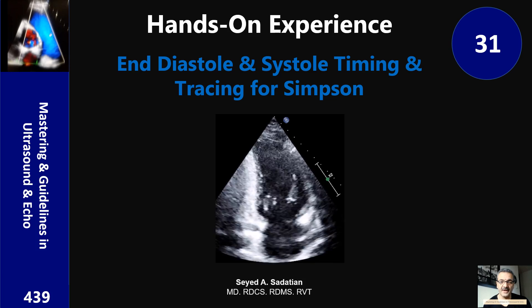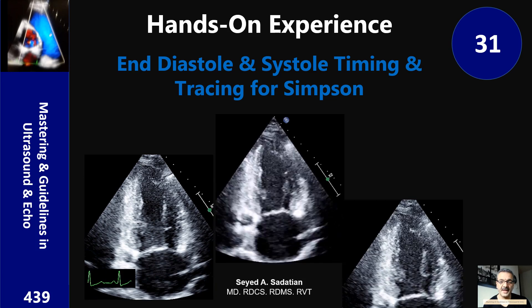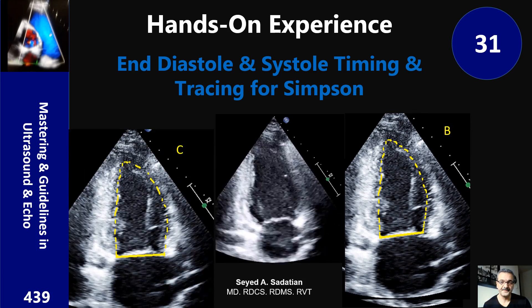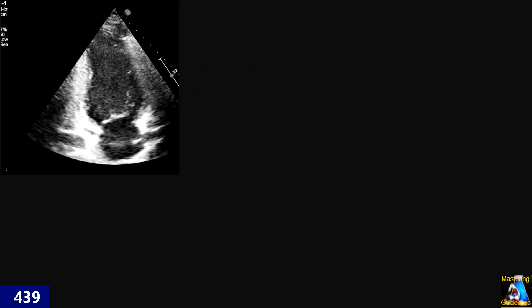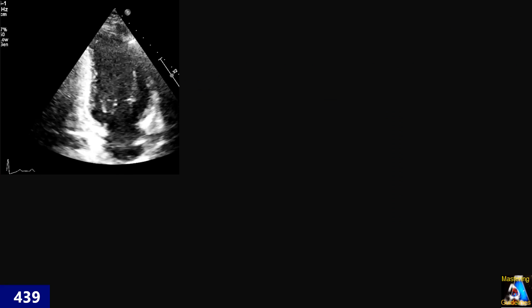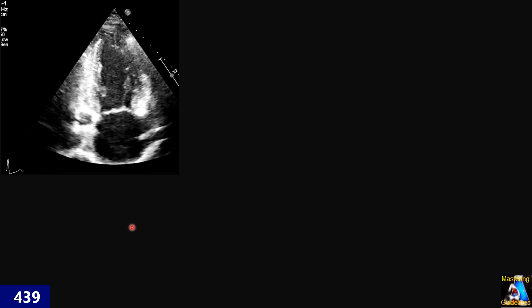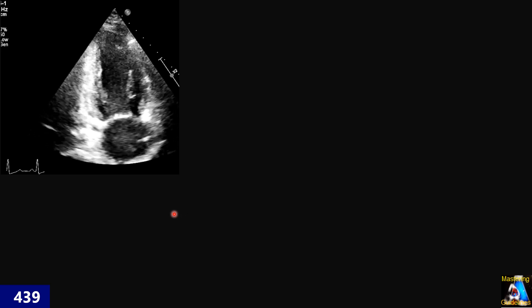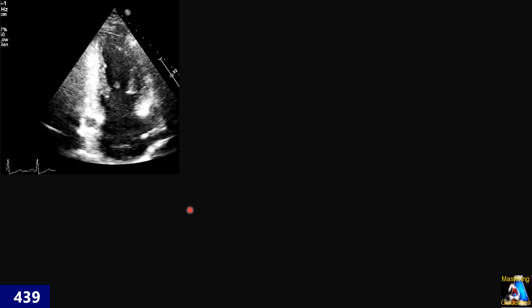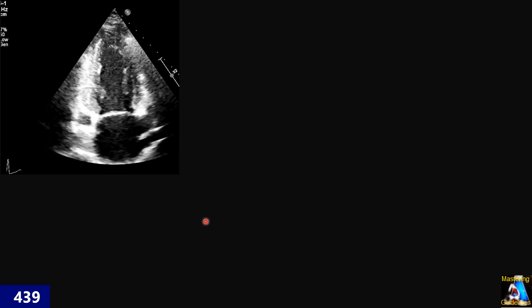Welcome to mastering guidelines in ultrasound and echo. Hi everyone. I noticed that many techs and even cardiologists make mistakes in tracing the endocardium and the timing of the tracing for Simpson's method, especially in the apical two-chamber view.